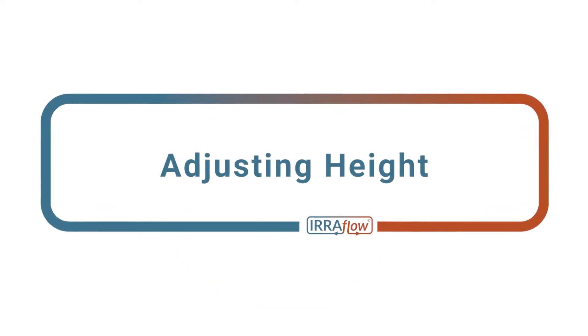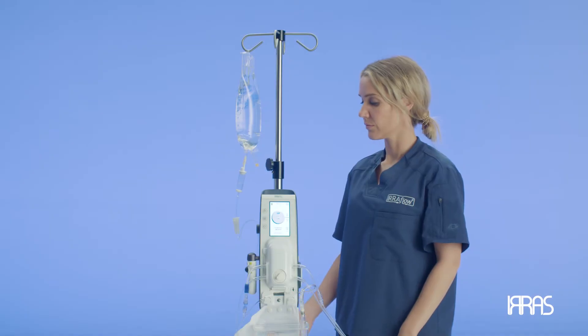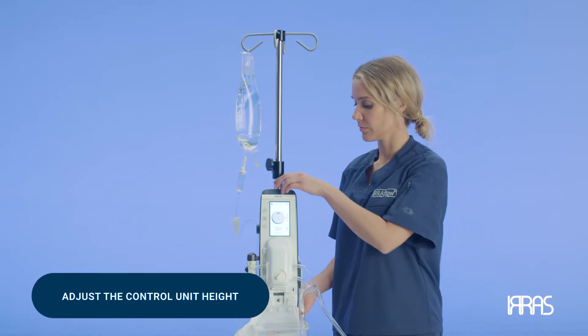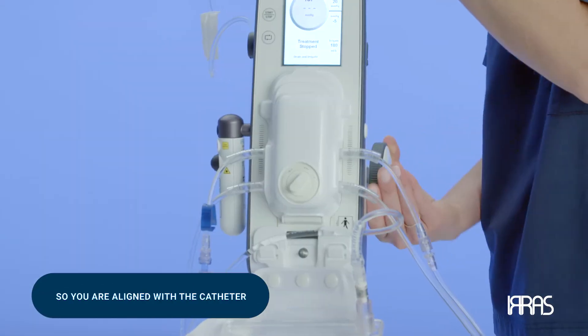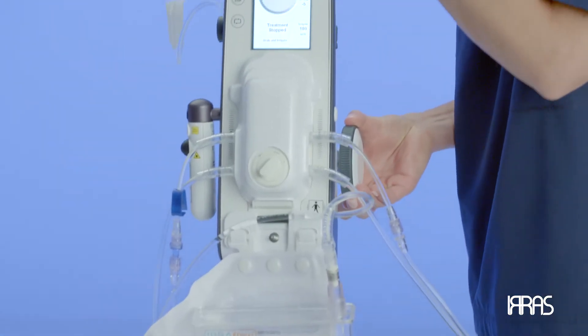Chapter 6: Adjusting Height. You have now successfully set the IRRAflow control unit up and are ready to adjust the control unit height so that you are aligned with the catheter. This will ensure you are obtaining the accurate ICP reading.